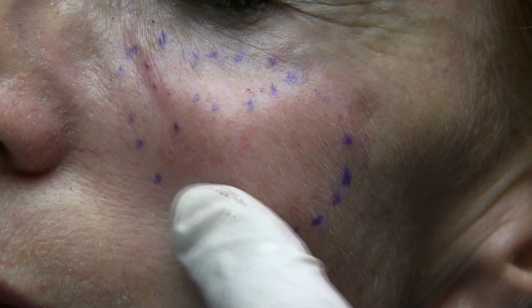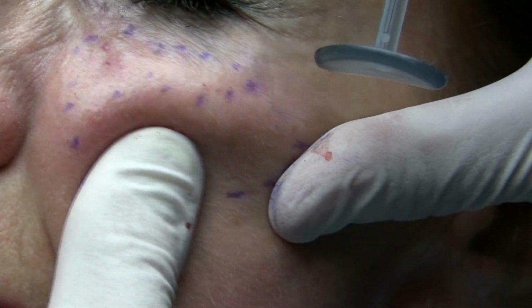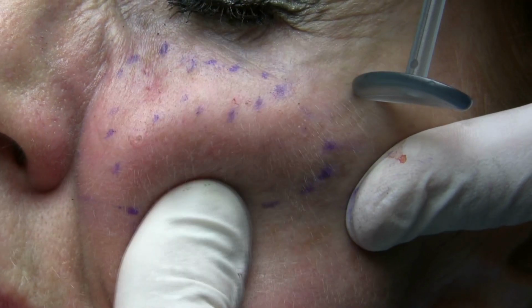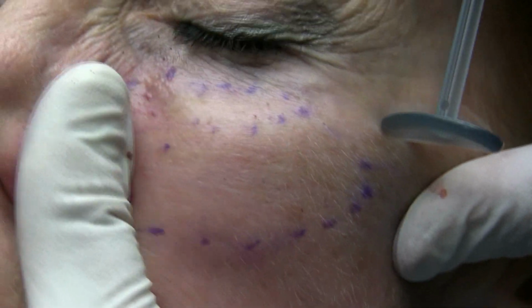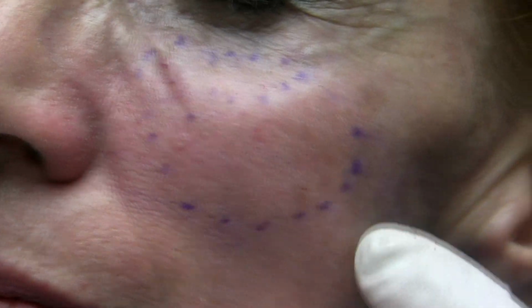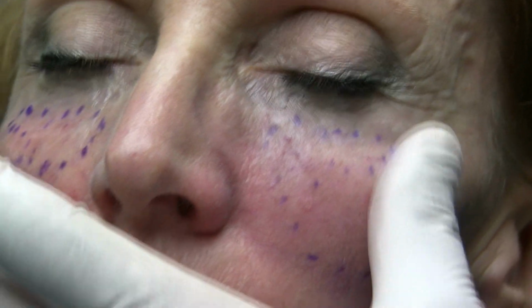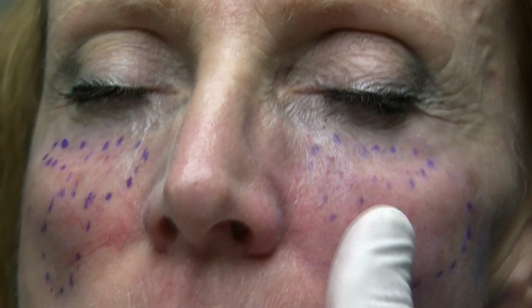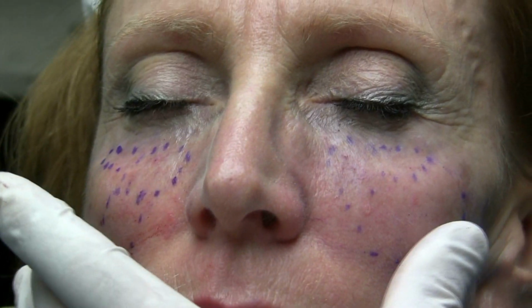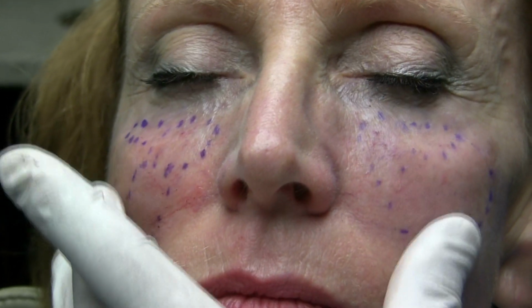And if you ever look at a cheek implant, this is about the exact shape of it. And what we're going to do is just add some filler here. And when you have a patient that will purchase the sufficient amount of filler to do a job, it is amazing what you can do with filler. And I'm not a proponent of, quote, liquid facelifts because I think it's a very expensive short-term fix. But for situations like this, there's no better non-surgical treatment.